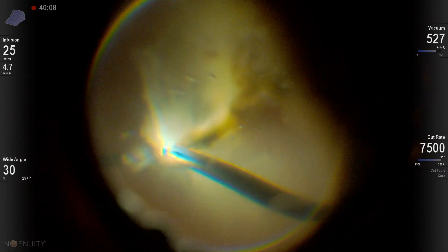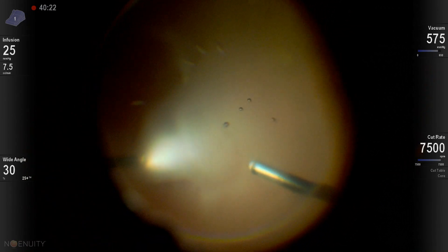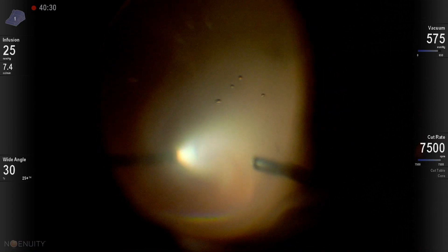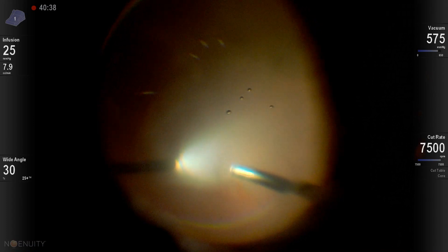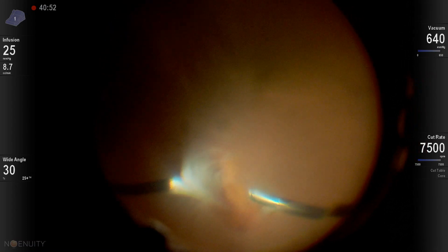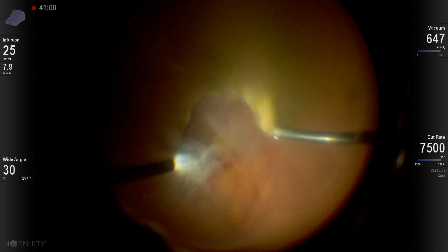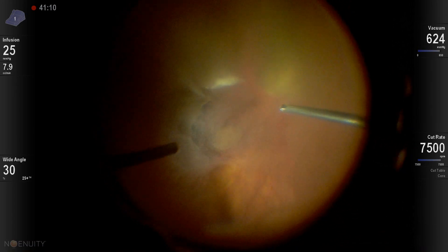Now, this is the main focus of the video clip on what I call a vertical vitrectomy. When you cannot see the retina, we'll start cutting vertically up until you start seeing the retina. The idea is that if you create a retinal break — if you're cutting into the retina — that would be superiorly. It also saves a lot of time, because many times you're not sure and time is wasted until you find what's happening. Then we can see the retinal blood vessels as we complete the vitrectomy step.